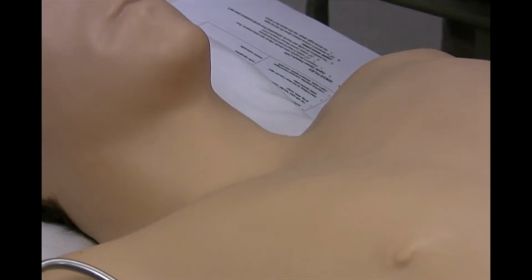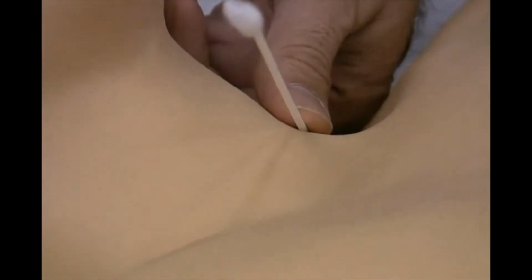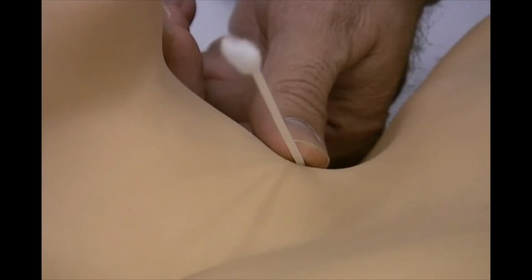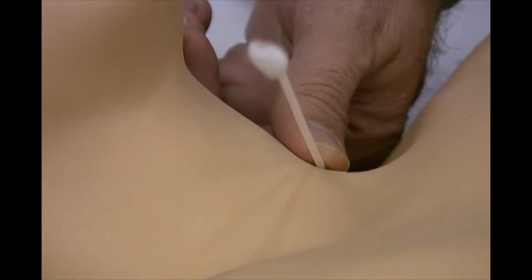This is a sneak peek at what's going on the right side of the heart. There are 2 things that we want to notice with the venous pulses. First, we want to measure how high the pulses are, and that gives us an idea of the pressure on the right side of the heart. The second thing is the actual waveforms. I'll show you the waveforms here in a minute. As you can see here, I'm going to exaggerate this a bit and see Harvey's neck veins. In this case, he has exaggerated V waves, and we're going to talk about the A, C, and V waves in just a minute.